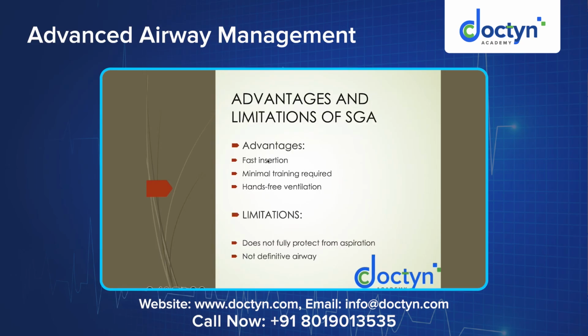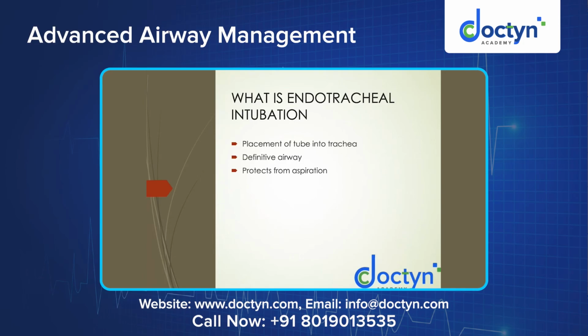Advantages and limitations of supraglottic airway. Advantages: fast insertion, as I said, minimal training is required, hands-free ventilation. What are the limitations? It does not fully protect from aspiration, as we discussed earlier. There is a risk of gastric insufflation, a risk of trickling of gastric secretions into the perilaryngeal space, and a slight risk of aspiration. It is not a completely definitive airway, and you cannot maintain this patient on a supraglottic airway device for ventilation for a longer period of time. This is just like a bridge to endotracheal intubation.